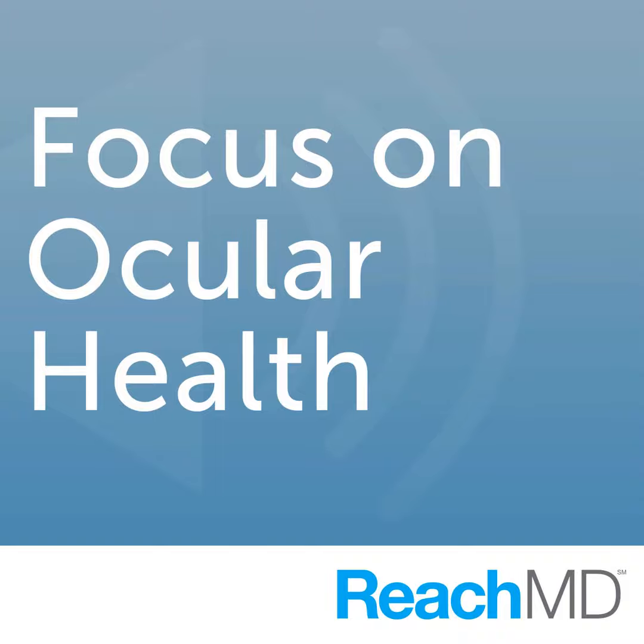What does the physician see on the monitor when a scan is done? The newer instruments actually use a combination of the view that you would get from the ophthalmoscope, sort of an en face or direct view. So you can actually see the fundus, very much like contact lens or indirect ophthalmoscope view. And simultaneous to this, they will see a cross-sectional image, which will show really from the vitreous down into the choroid, and all the layers of the retina are readily available.